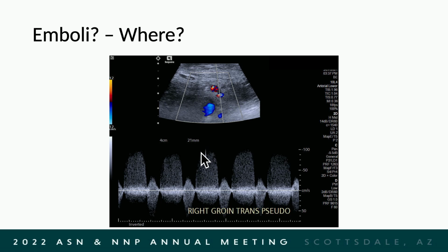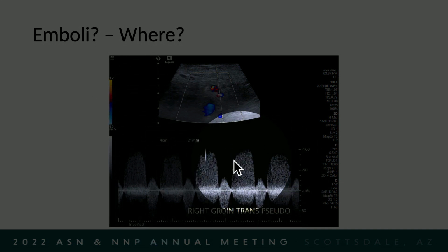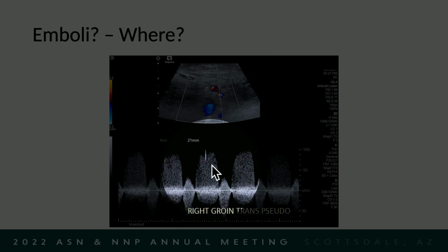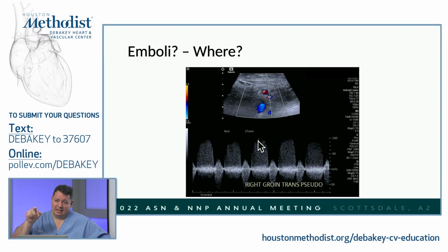So what's this? For me, this is stunning, this is again a pseudo waveform. This is the neck of the pseudoaneurysm, and here is a tiny microembolic signal, a tiny clot. So you are picking it up. What does it tell you? It goes towards the neck. What does it tell you again? It's not coming from, it's maybe going into the PSA. Those are the really fun directions that we need to figure out. If this is negative, maybe it's coming out or going into the PSA.